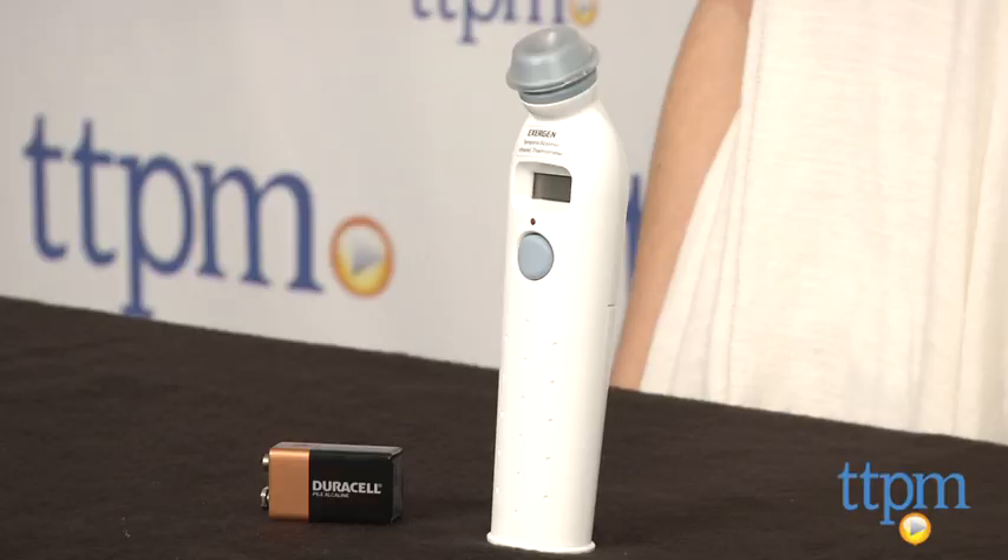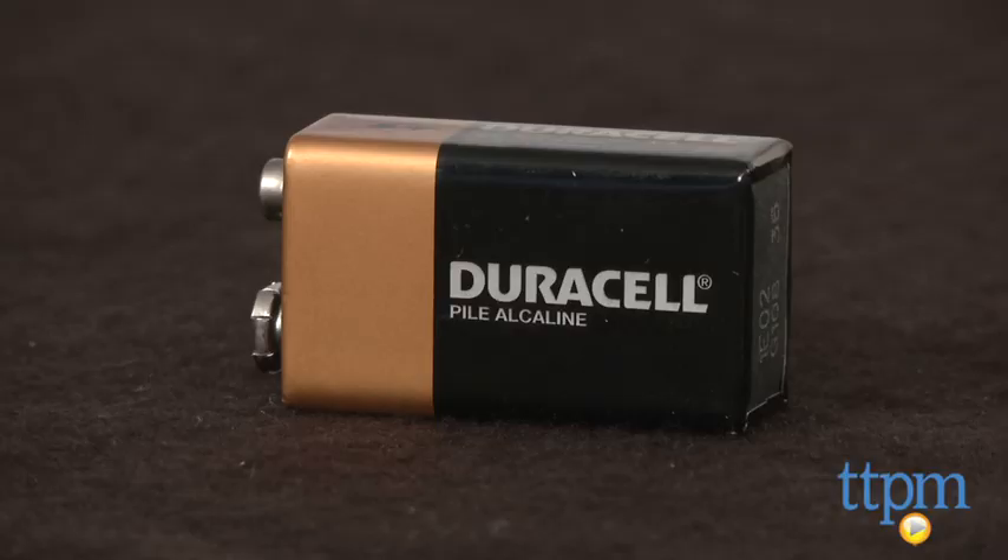Hi, I'm Tammy with TTPM. As a mom of two-year-old twins, I have tried every method of taking my girls' temperatures and am yet to find an easy one, until today. This is the Temporal Artery Thermometer from Exergen.